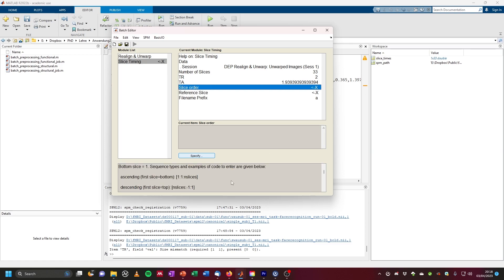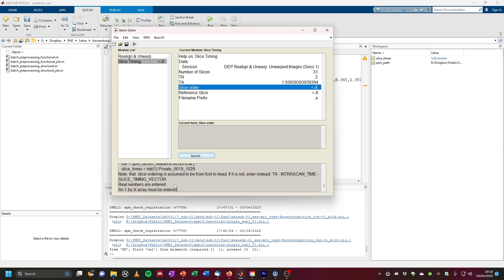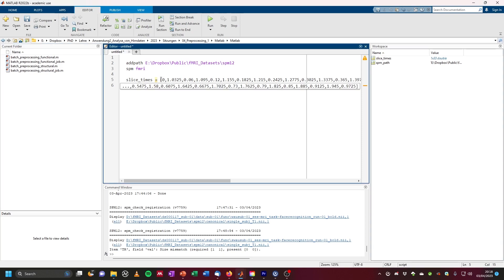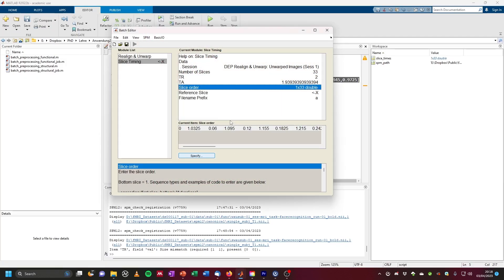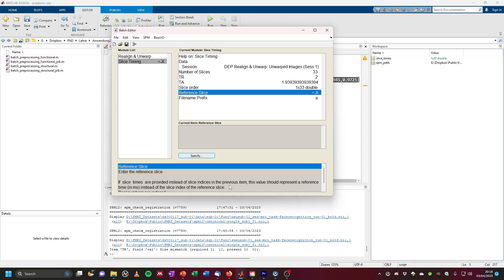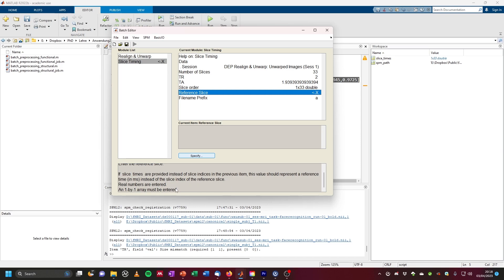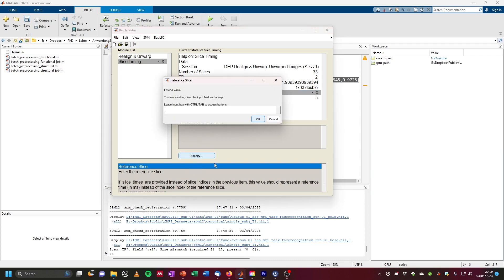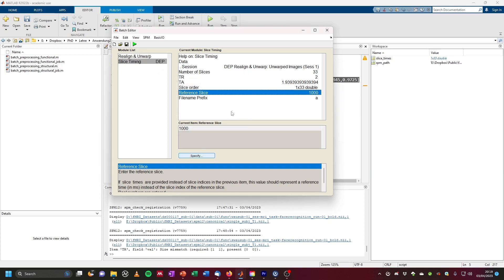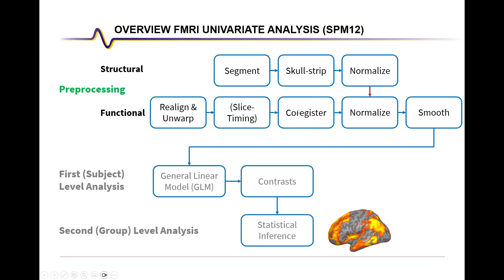For slice order, we can specify ascending or descending, or simply put in the exact slice times — we have these in our slice_times vector, so we can copy this and paste it in. For the reference slice, this is the time that every other slice is adjusted to. A good rule of thumb is to take the middle slice to minimize overall shifting. Since TR is 2 seconds, this would be 1 second, and since it wants the time in milliseconds, we put in 1000. That completes slice timing.